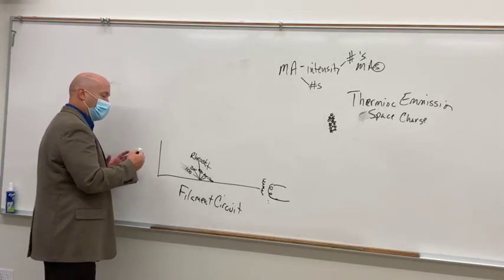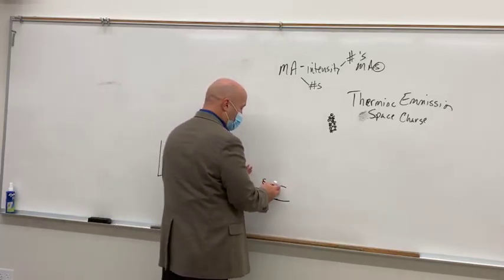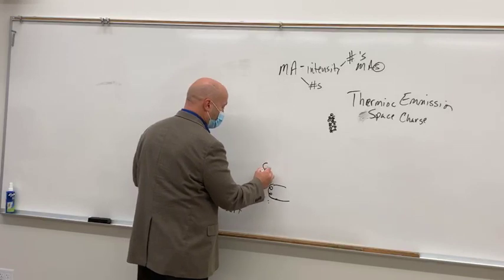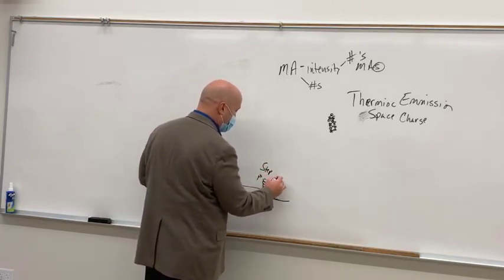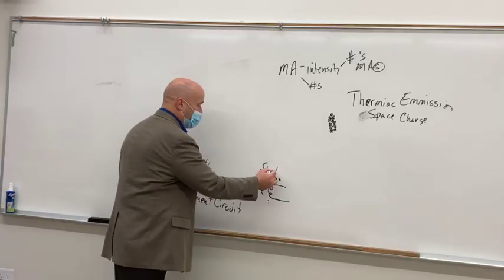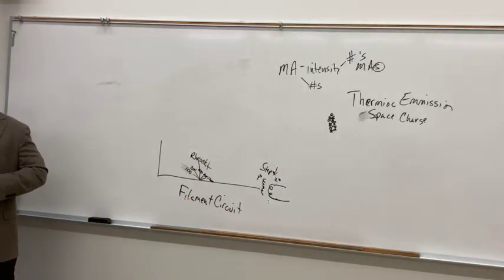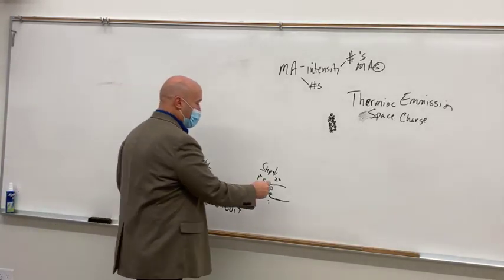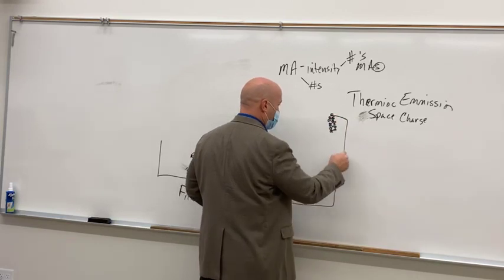So in the low voltage circuit, we've got a rheostat. Comes out of the rheostat, goes into the step down transformer. Remember, we've got a primary side and a secondary side. What are we stepping down here? Voltage, right. We're stepping down voltage. And then it comes out of this and it goes into our filament.